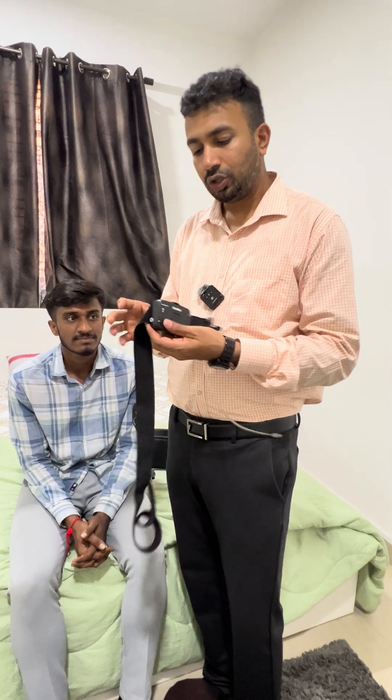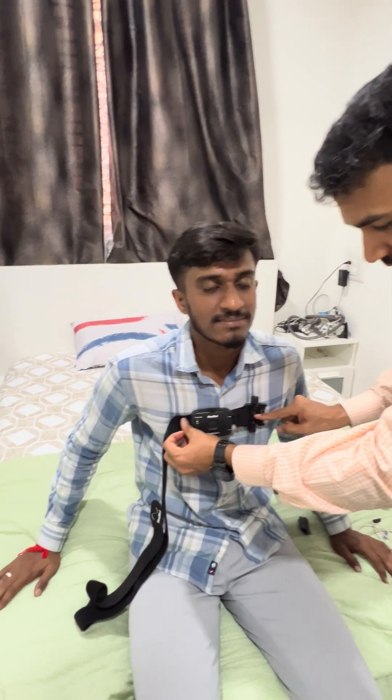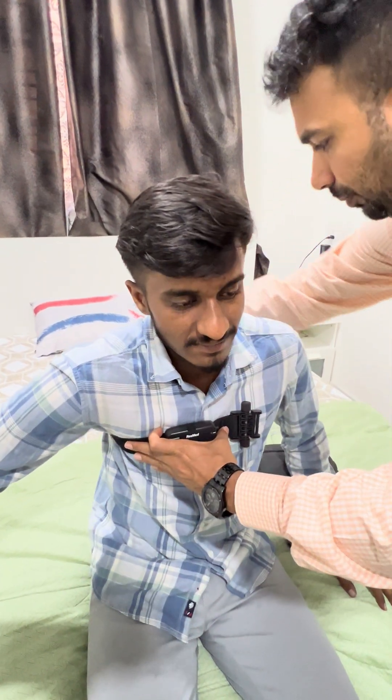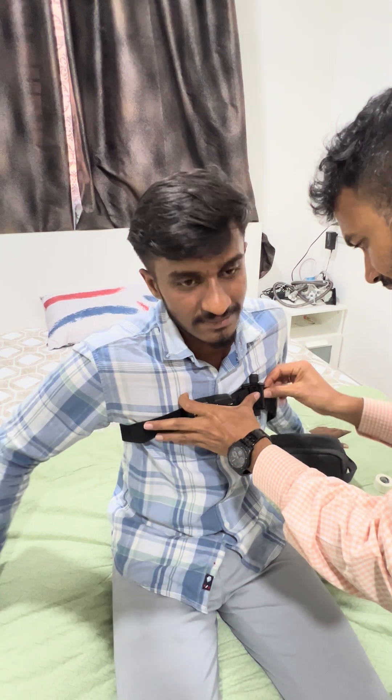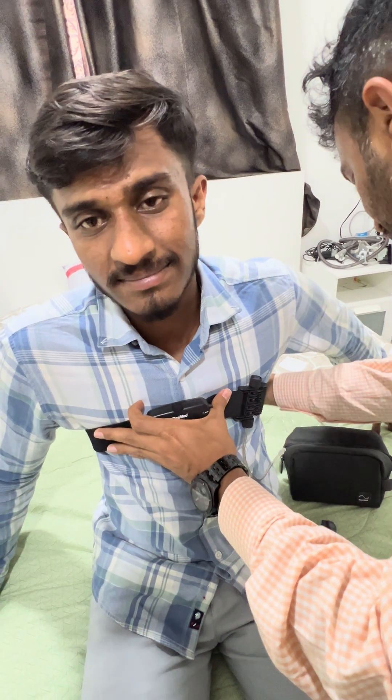This is the main unit of the device and it is to be placed on the chest. The sensor should be somewhere close to the heart. Then we have to take the belt and wrap it in such a way that the patient is comfortable — it shouldn't be too tight or too loose.